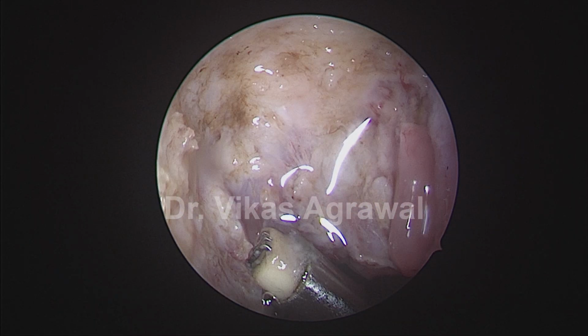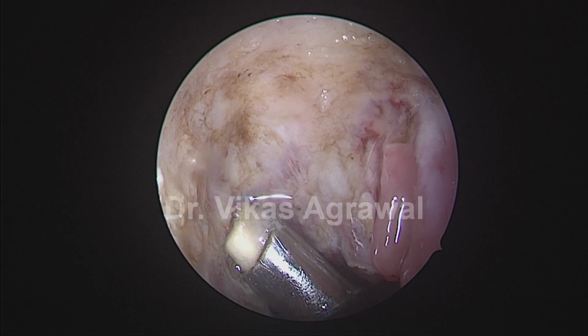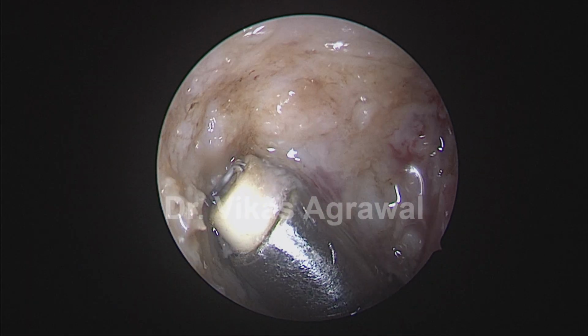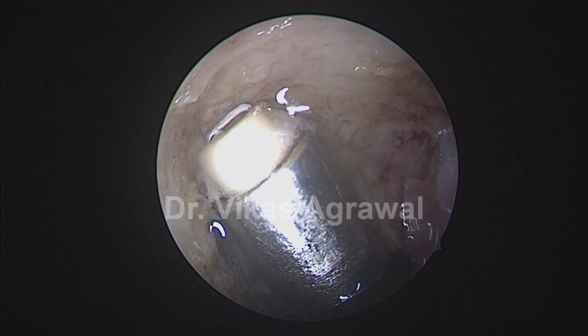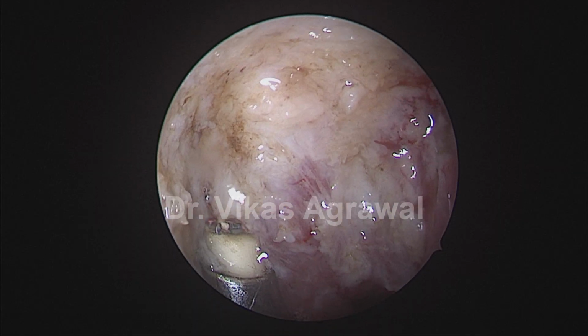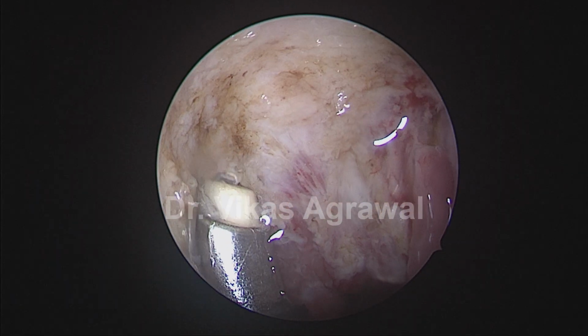That is the fossa of Rosenmuller. And you can see that almost every bit of lymphoid tissues are removed. Now I'm going for the posterior boundary, which is the buccopharyngeal fascia.